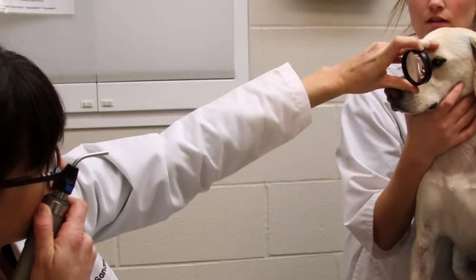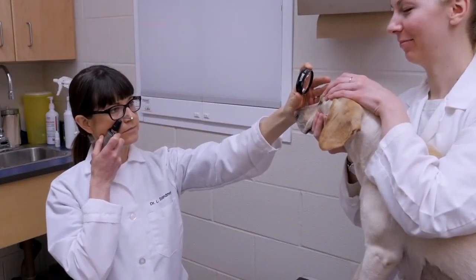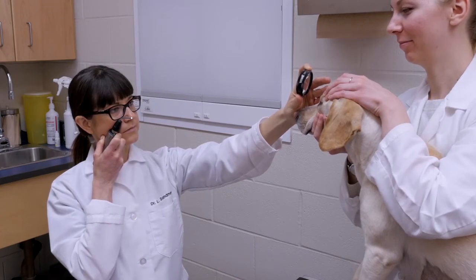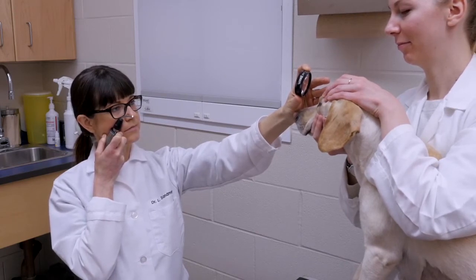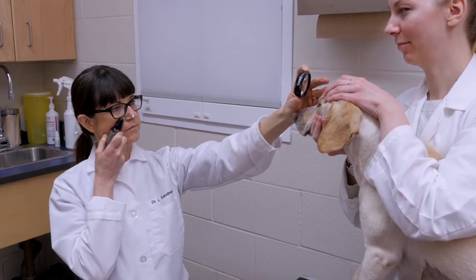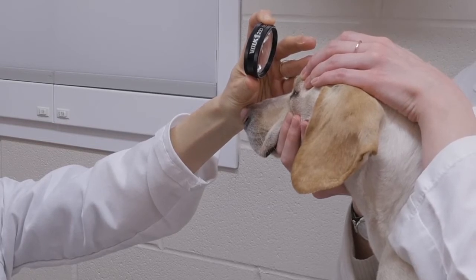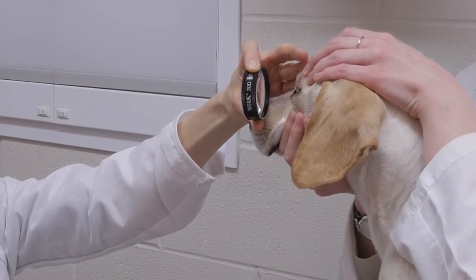To obtain a fundic image, the light, lens, and pupillary aperture must all be directly aligned with one another. To do this, the light source is stabilized next to or just below the examiner's eye to ensure that the examiner's eye and the light are in alignment. With the examiner sitting at arm's length away and a little lower than the animal, the tapetal reflection is elicited by shining the light through the animal's pupil. Once a good tapetal reflection is obtained, the lens should be lowered in front of the cornea and aligned with the light beam to obtain an image.